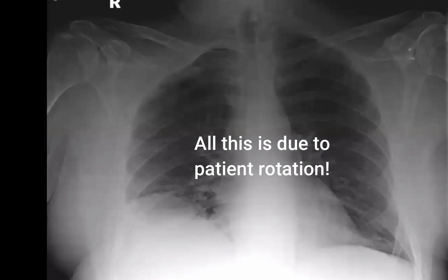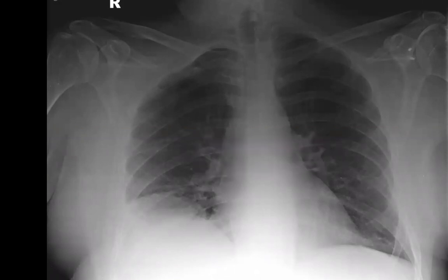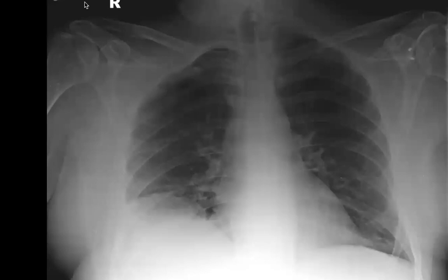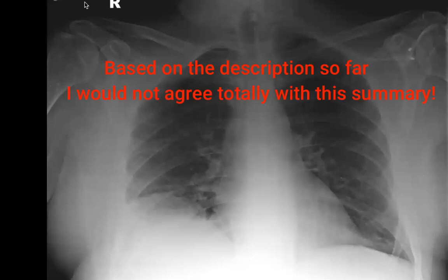I suspect these are lymph nodes and I suspect this is right basal consolidation. I cannot see any hilar masses. I'd like to assess this patient with contrast-enhanced CT of the neck and chest. My differential diagnosis is a malignant condition with lymph nodes.